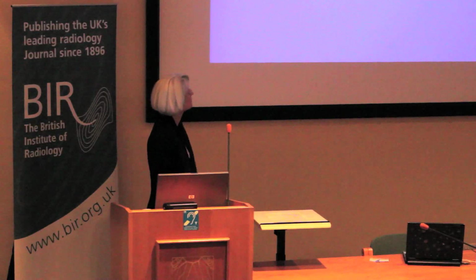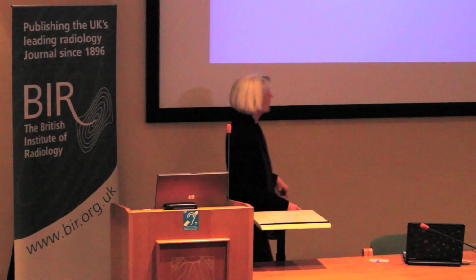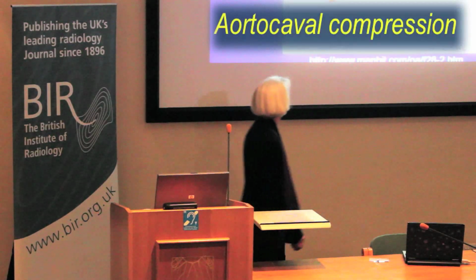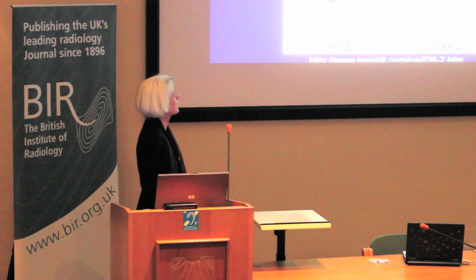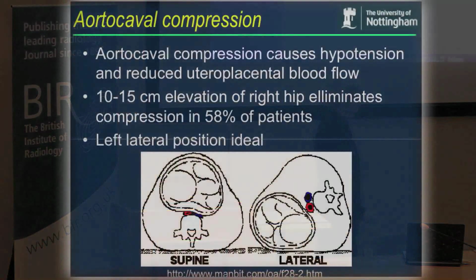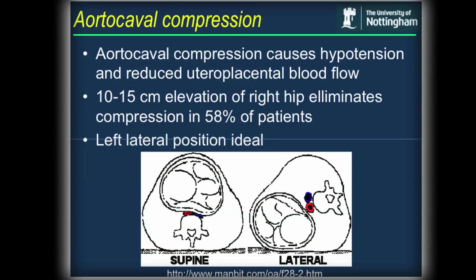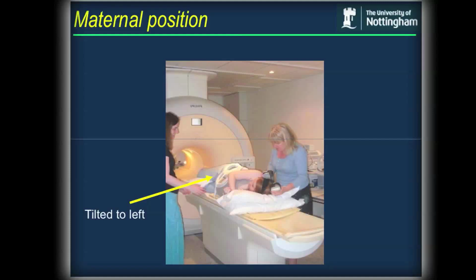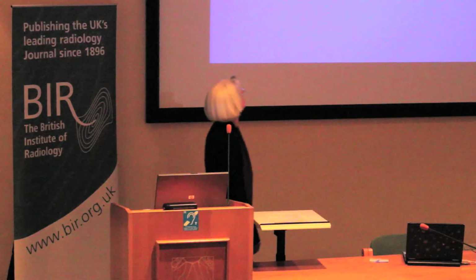Possibly the most important practical thing to do with imaging fetuses, and I'm sure everybody in this room probably knows it, is inferior vena cava compression, and I'm sure we've all come across it when scanning. Basically, if you lie a pregnant woman on her back, she doesn't like it. You should tip them to their left-hand side, because otherwise their vena cava gets compressed. They feel sick, get sweaty, get shocked. So basically, when pushing them in, as far as possible, lie them on their left. Actually, I have to be honest, I swapped this picture over. This is actually a picture of someone lying on their right. It doesn't really matter if they're on the right or left, but ideally on their left.